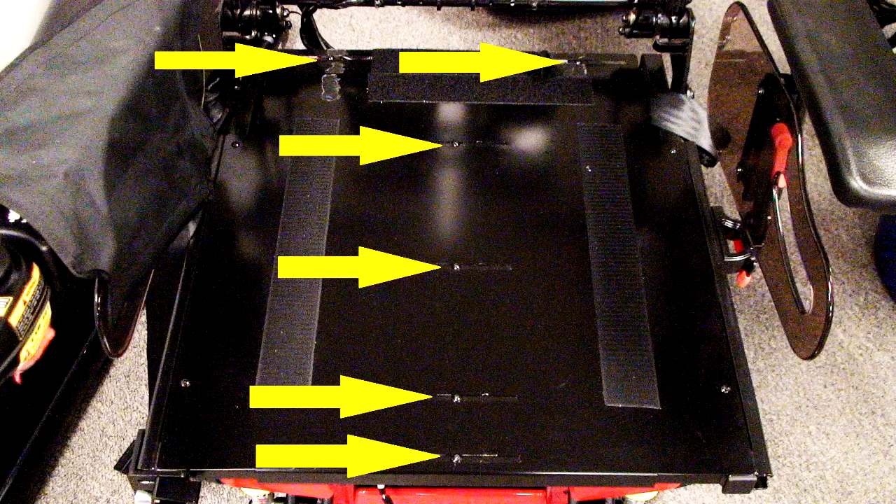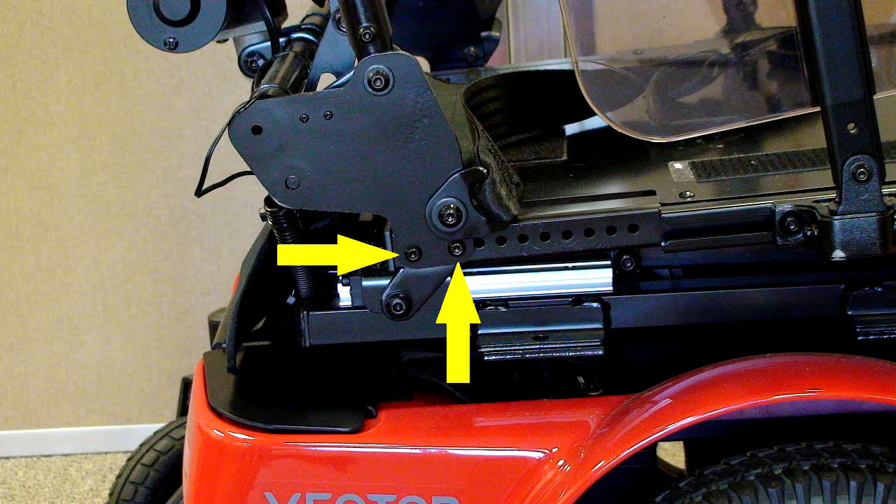The next thing you'll want to do is loosen but do not remove the six 3-millimeter seat pan screws. Next, on both sides of the seat back on the base, loosen but do not remove two 4-millimeter allen screws with 10-millimeter nuts as shown. This will make the frame a little less rigid and give us a little wiggle room while we're trying to maneuver the sections to place the screws in their proper place a little later on.